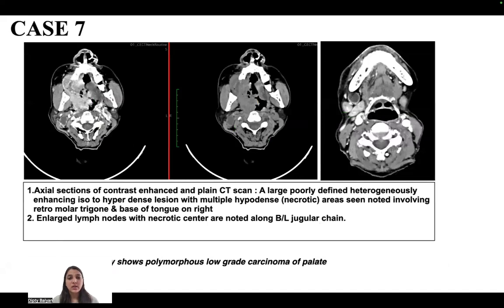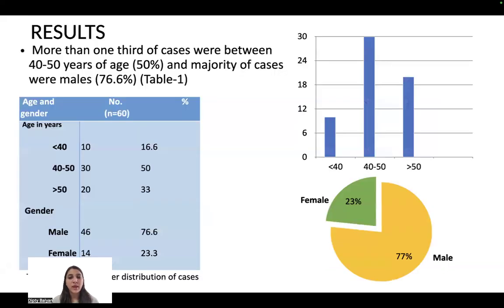In another case, a large poorly defined heterogeneously enhancing iso- to hyperdense lesion with multiple necrotic areas is noted involving the retromolar trigone and base of tongue on the right side. Large lymph nodes with necrotic centers are noted in the bilateral jugular chain. Histopathology shows polymorphous low-grade carcinoma of the palate.